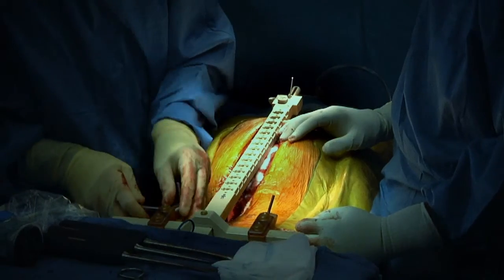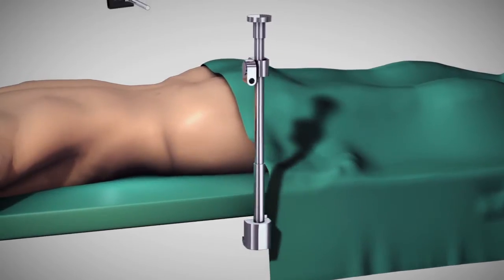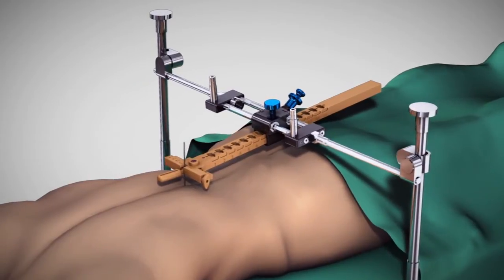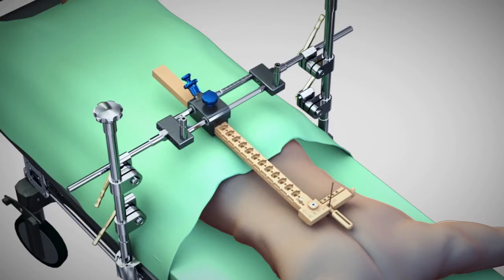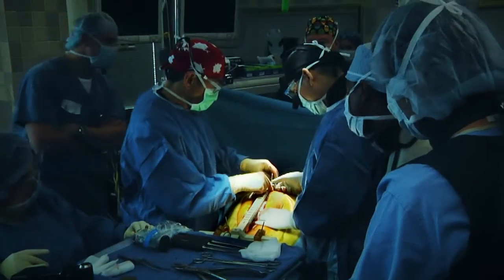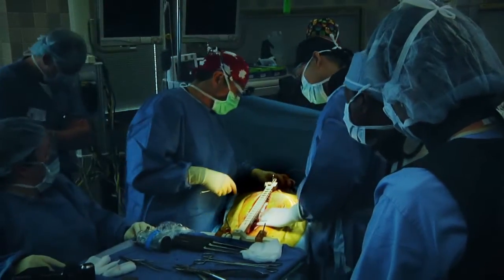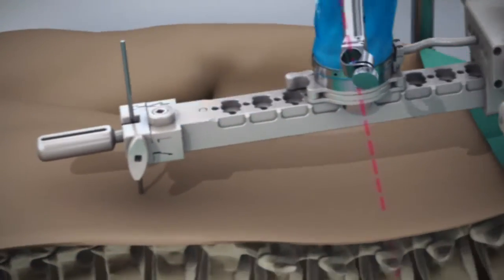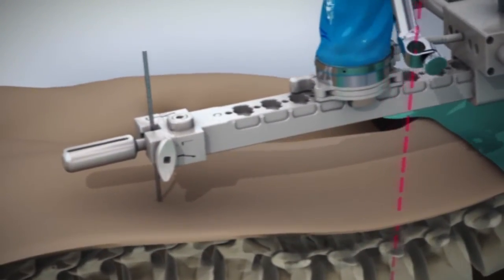The multi-directional bridge mount attaches to the railings on both sides of the bed and a K wire to a spinous process. Its bridge can be translated laterally in parallel to the patient's spinal column. The multi-directional bridge mount is particularly well suited for minimally invasive surgeries since only a single K wire is used to rigidly attach it to the patient.